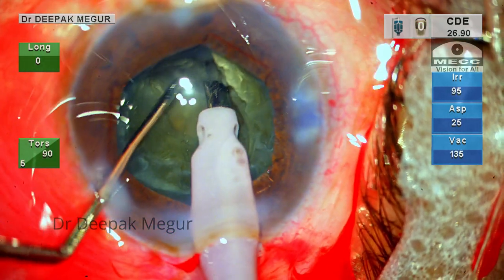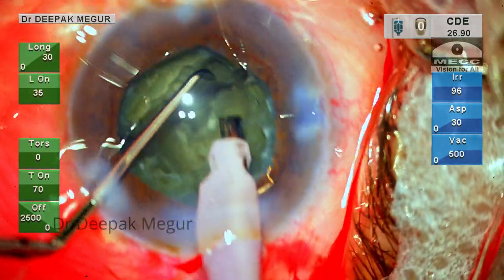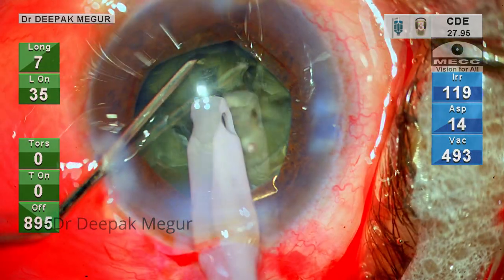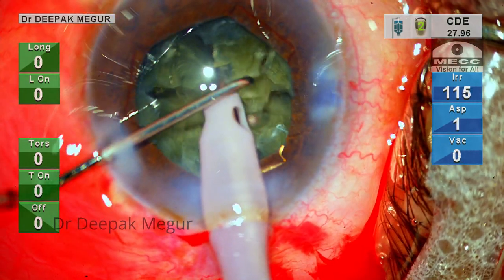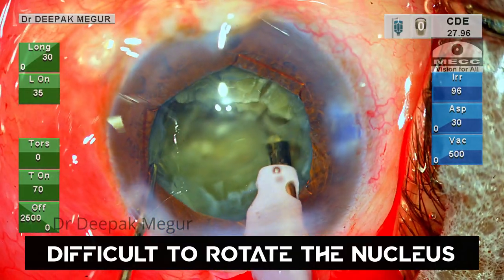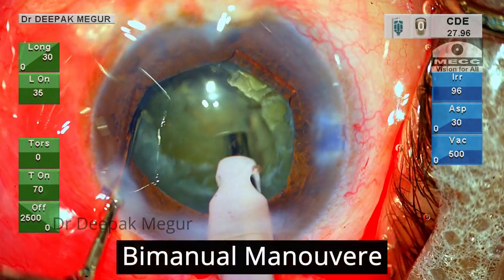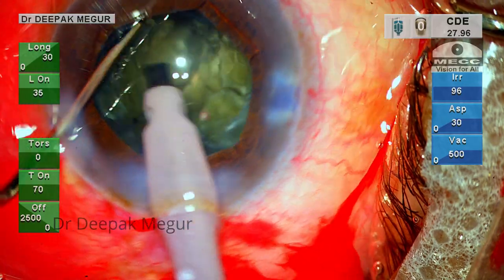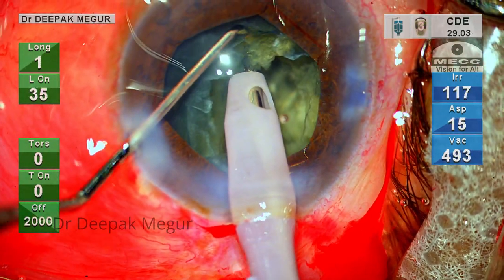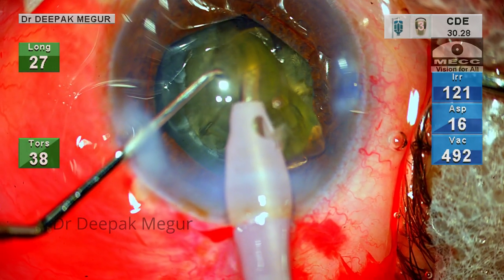I am using both instruments to aid in rotating the nucleus, which works well. The first heminucleus is chopped into three smaller fragments. I find it difficult to rotate the nucleus because of the severe zonular laxity, and I realize that earlier insertion of the CTR would have minimized this issue by providing strength to the bag. Nevertheless, the bimanual technique of rotating the nucleus gets the job done — this bimanual mobilization is critical in eyes with diffuse zonular laxity. The second heminucleus is similarly divided and each fragment is emulsified in a very controlled manner.